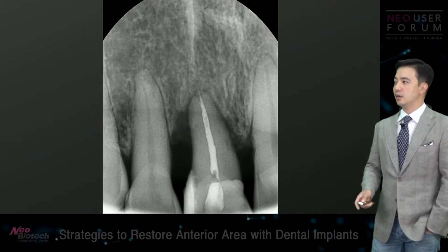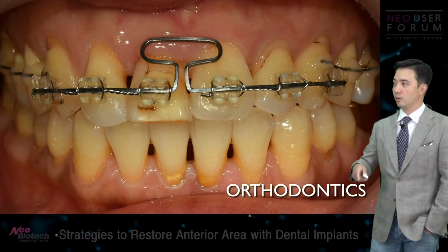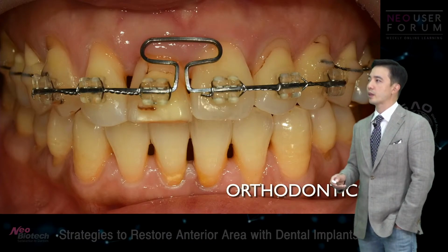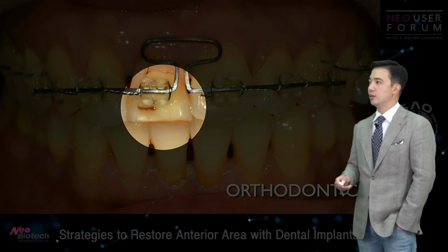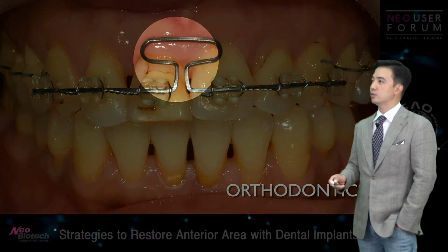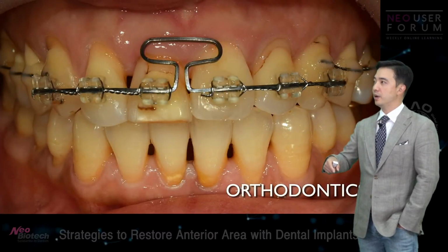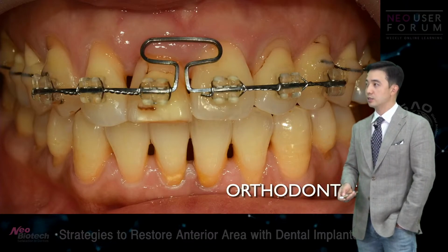So I did endodontics because I was going to passively do the orthodontic eruption, okay? As you can see, I kept grinding the crown of number 11, and look at the gingival level of this. Compared to number 21, my number 11 now is apically about 2 millimeters lower than number 21. So this is really favorable, right?